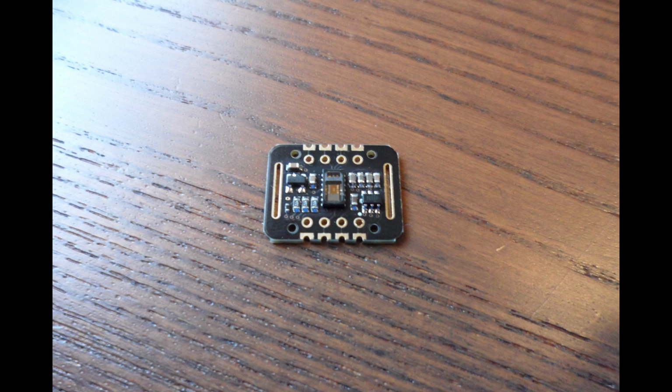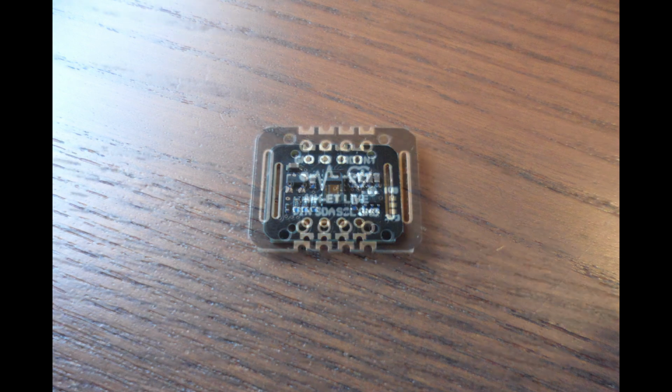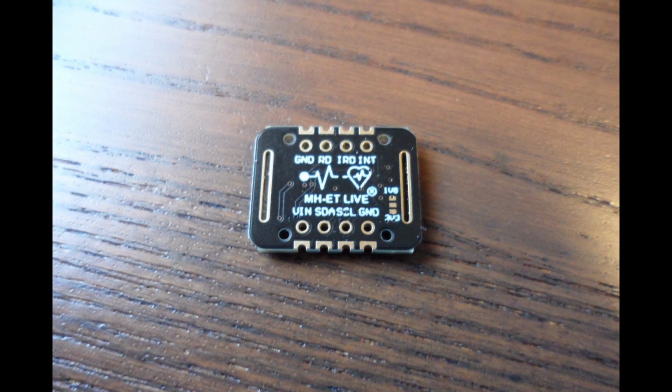And what I've got here is a small breakout board for the MAX30102. I picked up a couple of these off of Amazon for a few dollars each. On the front side, we've got the sensor itself, along with some discrete components, resistors and caps. On the back side, we've got screen printing to indicate the pin functions, along with a voltage select. Looks like we should solder a jumper for 3.3 volts here.